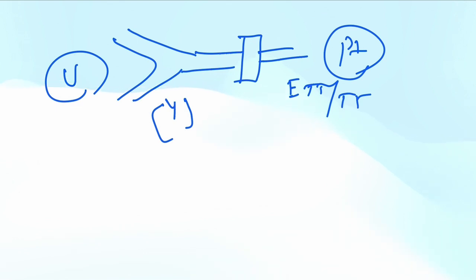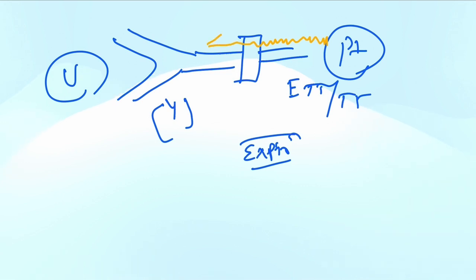So what happens during expiration? The filter collects the expired air, right? Though from the patient end we get the expired air. Okay, air gets passed through the HME, but the water vapor remains over the hygroscopic material of this side or patient side of the HME. So these just remain on this side of the HME, right?